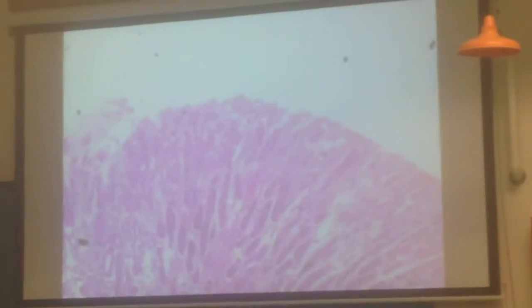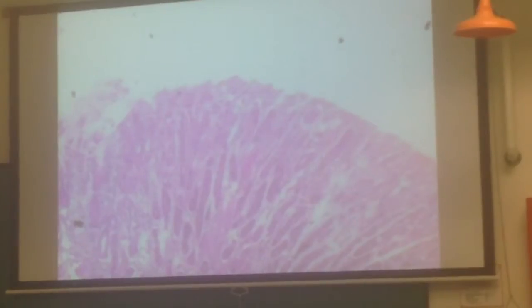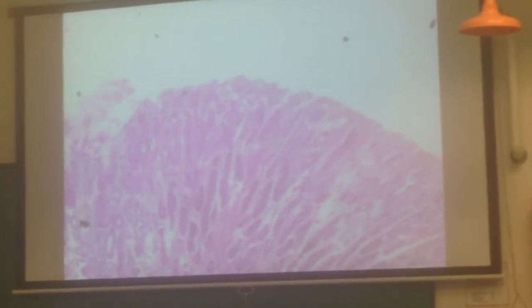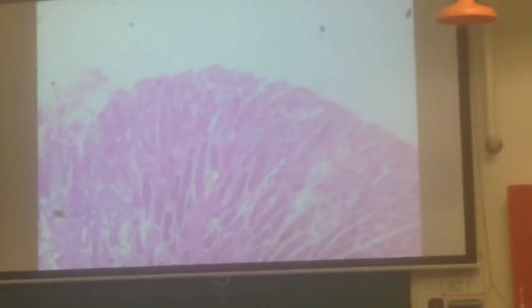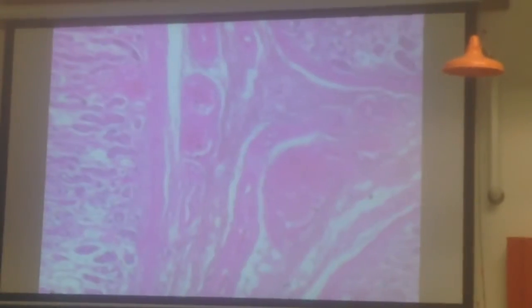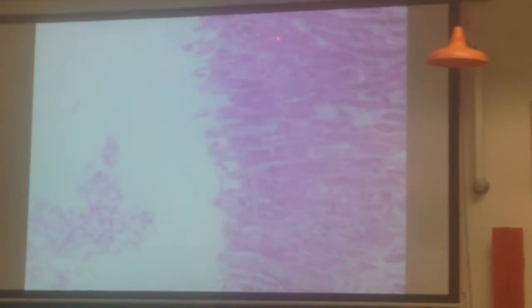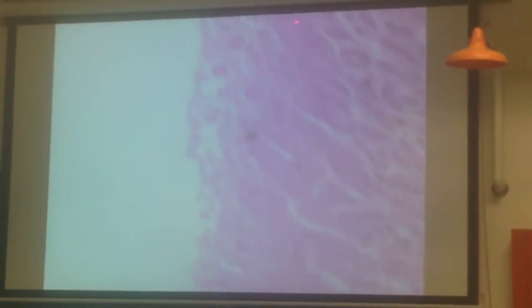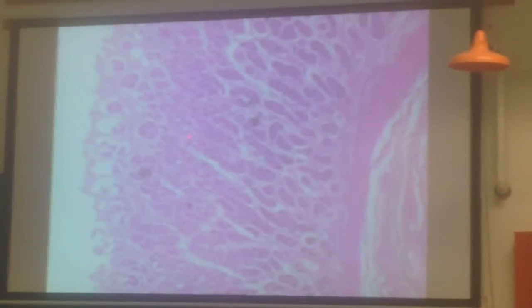Those are going to be lined with that columnar epithelial tissue, and some of those columnar cells are chief cells, some are parietal cells, and if you look closely, you'll see some goblet cells in there, those mucus-holding cells. Like I said, I don't like to zoom in too much, so I don't usually bug you guys about that stuff. But it's cool to see when you see them. Once you learn the difference between chief and parietal cells, which I'm not going to make you do, except functionally different, not structurally, you'll see that they're regionally located throughout the structures here.